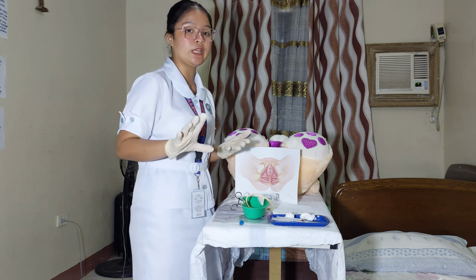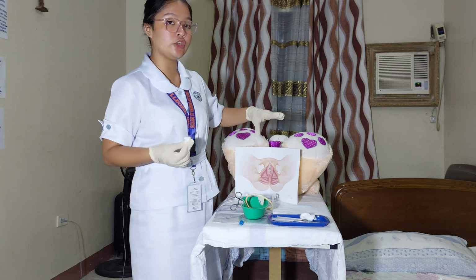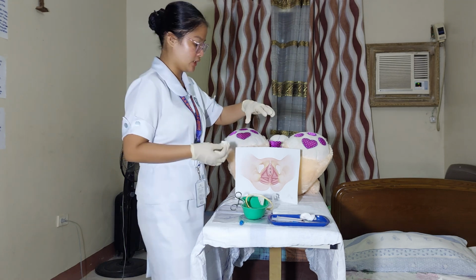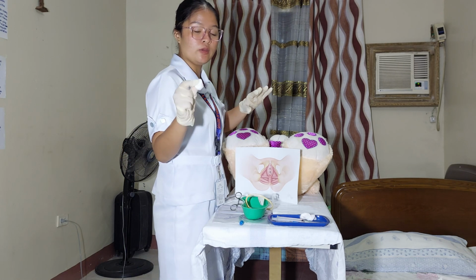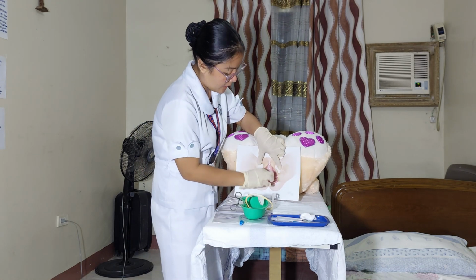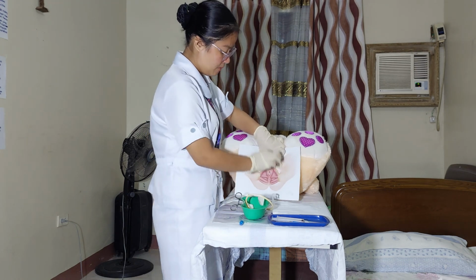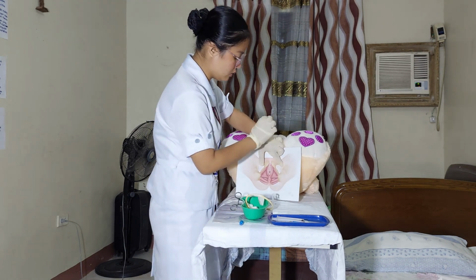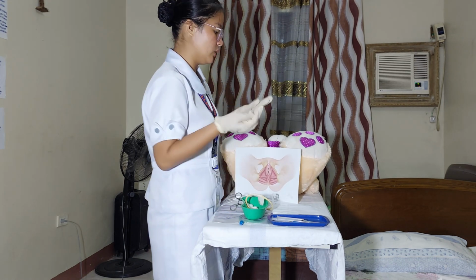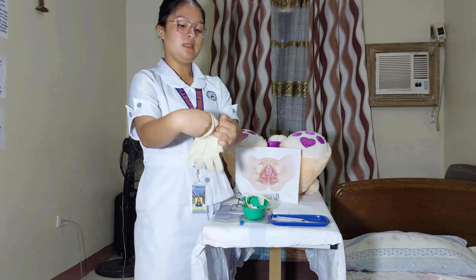So after removing the catheter, I'm going to get dry cotton balls and I'm going to clean and dry the perineal area of my patient. For cleaning the perineal area, I'm going to get one cotton, then wipe, discard, wipe, discard, wipe, discard. Then dry cotton to dry the perineal area. So I need to change my gloves now because they are already contaminated.